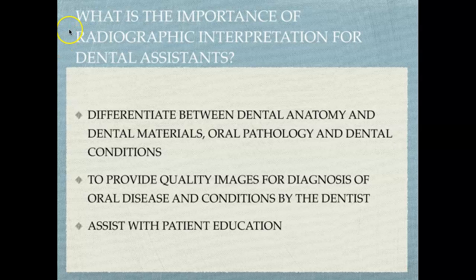So in conclusion, what is the importance of radiographic interpretation for dental assistants? We want to be able to differentiate between dental anatomy and dental materials, oral pathology, and oral conditions. By doing that, we're able to provide a quality image for diagnosis of these conditions and oral disease by the dentist and or the hygienist, and we can assist with patient education.